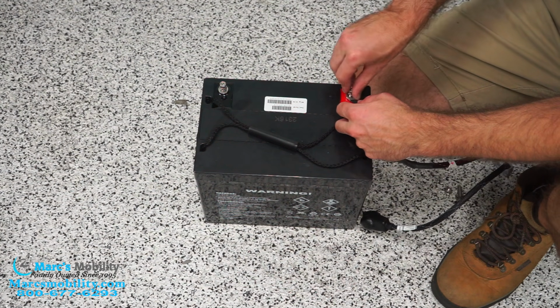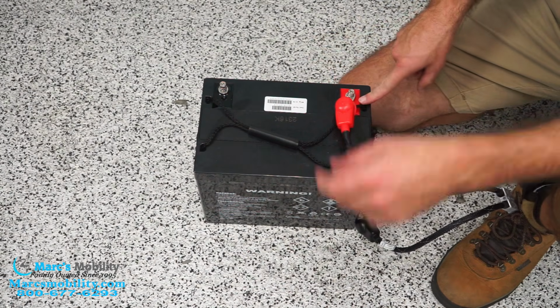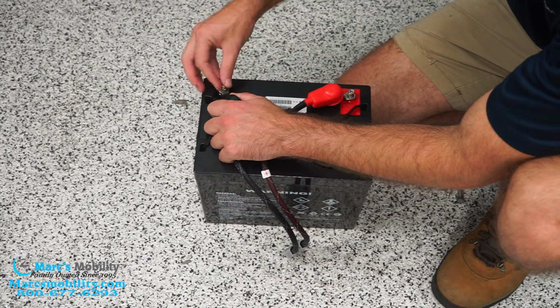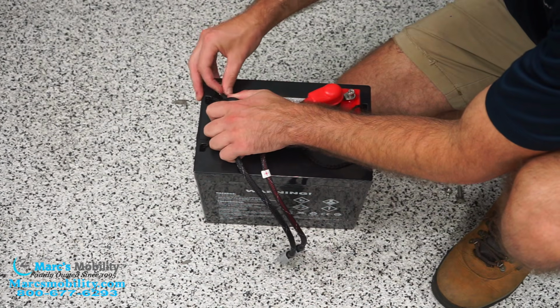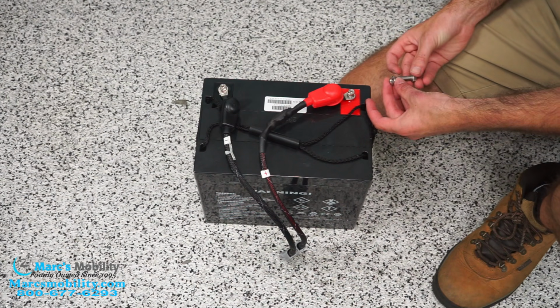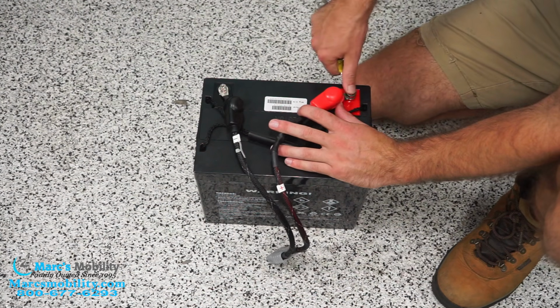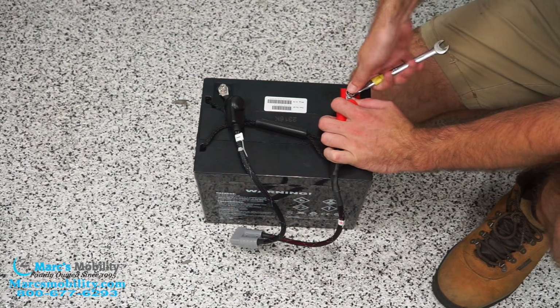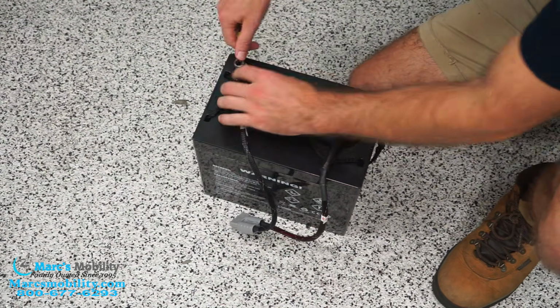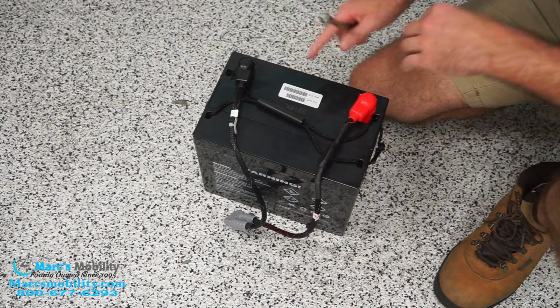So these are the exact same way as how we took them out. Make sure you're doing red to red, so you're positive to positive, and black to black, negative to negative. And like I said, this takes a 10mm wrench. If you do get the flag post terminal like this, it's usually a 13mm wrench. I have seen 14mm, but it's usually 13. Now we'll just tighten these up. Make sure they are good and tight. You do not want them wiggling around. Since this is an off-road scooter, you don't want these coming disconnected. They're both good and tight. Put your terminal covers back on, and now we're good to put this back in the unit.